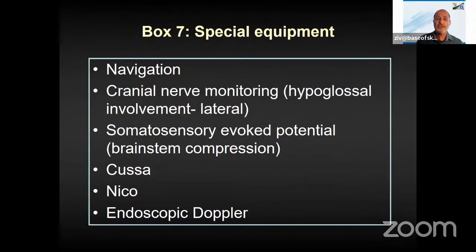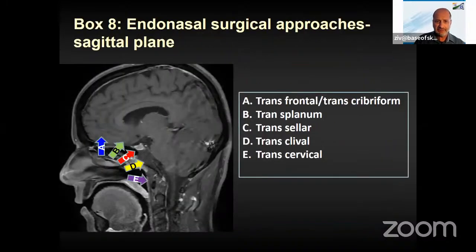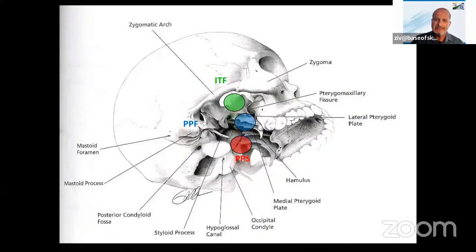Instruments are standard. We use in all of our cases cranial nerve monitoring, somatosensory evoked potentials, special instruments, and obviously navigation. I will not go into details of the transnasal endoscopic approach because that is beyond the scope of our talk, but let's concentrate on the infratemporal fossa.